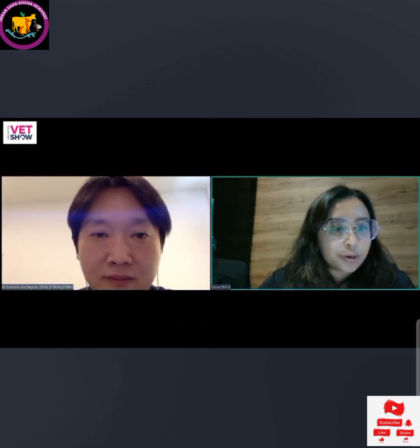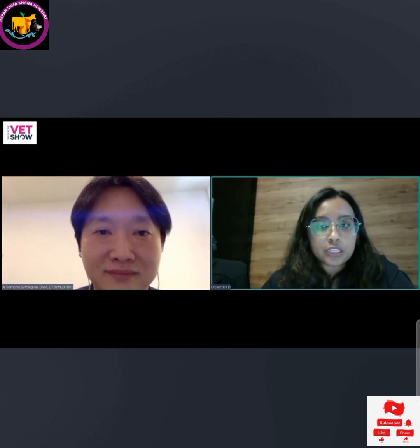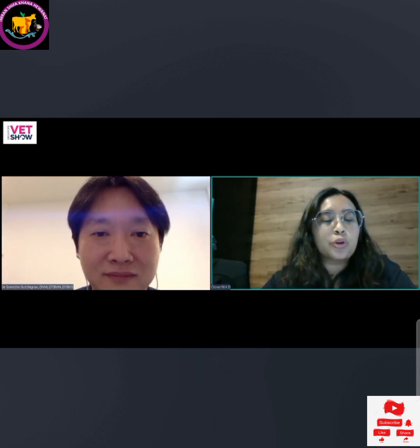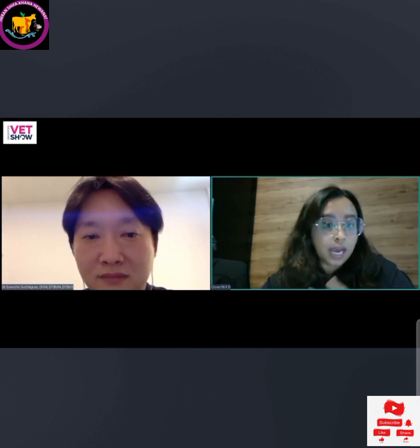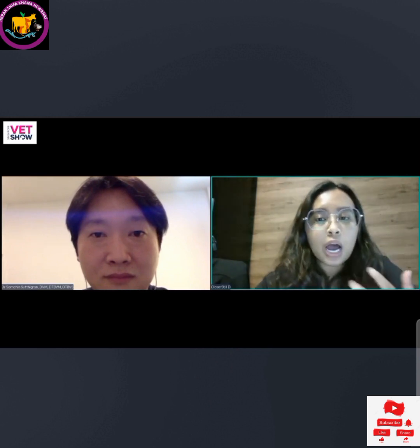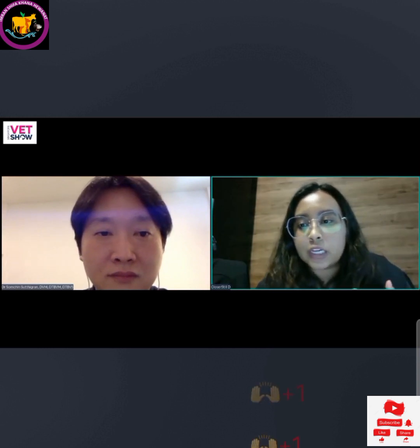Thank you so much for an insightful presentation. I think we certainly learned a few things from that. So right now we will be having the live Q&A session. Everybody who is watching, if you do have any questions for Dr. Somjin, please feel free to drop them in the chat box below. But while we wait for the questions to load, let me ask you one question: how can we differentiate between a thickened wall caused by a non-distended urinary bladder and cystitis?